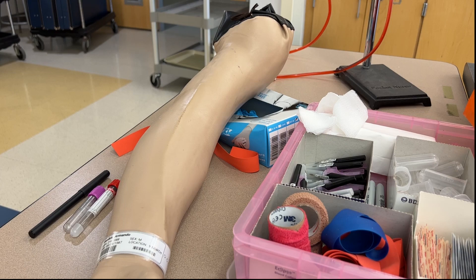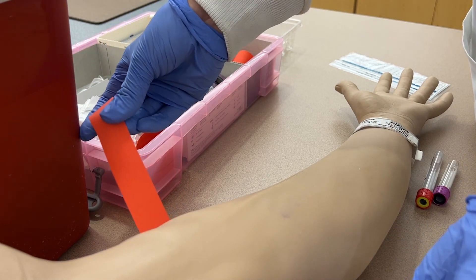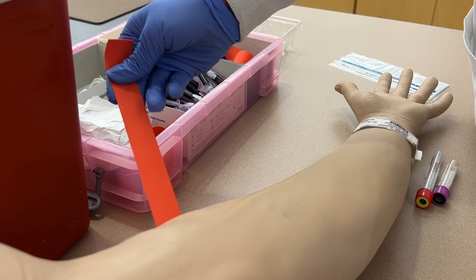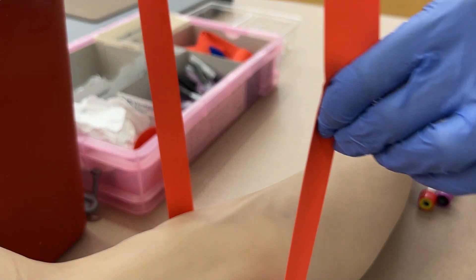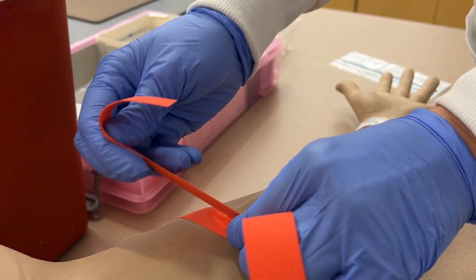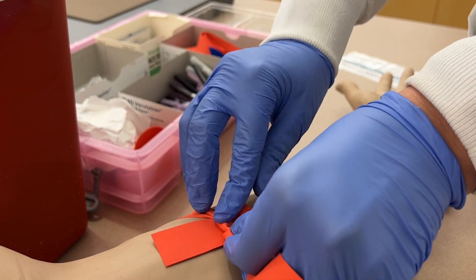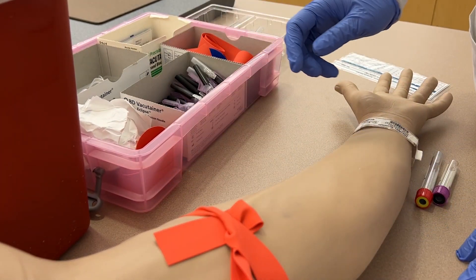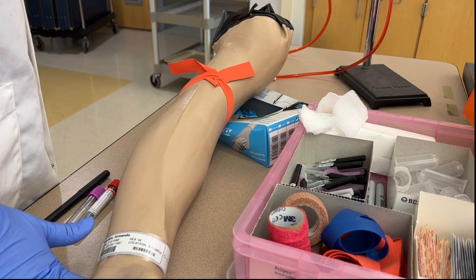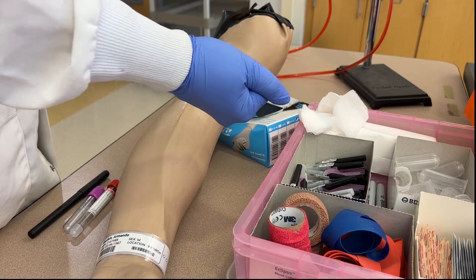Now we can assess the patient for their veins by tying a tourniquet around their bicep about three to four inches above the draw site in the antecubital fossa — pulling the tourniquet tight away from their skin so you don't pinch their skin, crossing the left tail under the right tail, pinching the intersection between your fingers, and then tucking the tail into the band leaving a small fold and a tail you can pull to quickly release the tourniquet. Once tied, have the patient make a fist and just hold it rather than pumping.